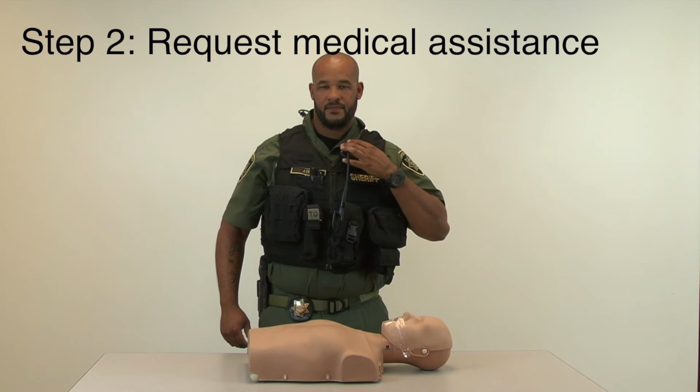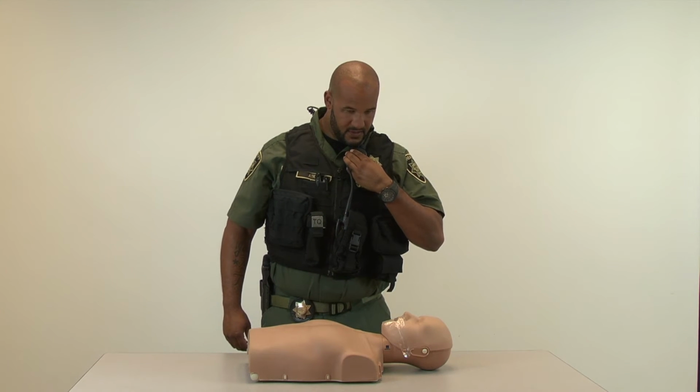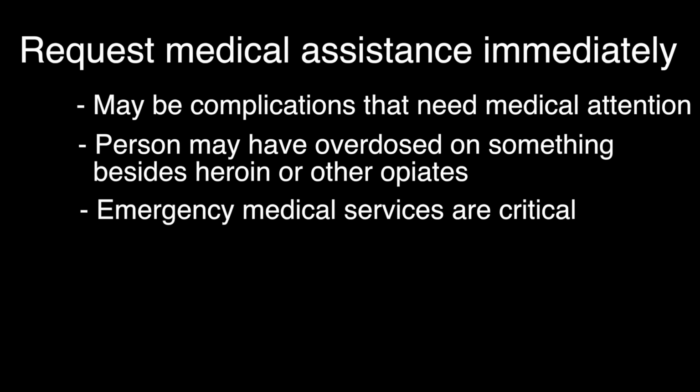Step 2. Request medical assistance. If the person does not respond and is not breathing, request medical assistance immediately. There may be complications that need medical attention, or the person may have overdosed on something besides heroin or other opioids. Emergency medical services are critical.